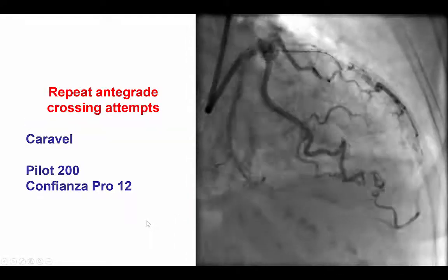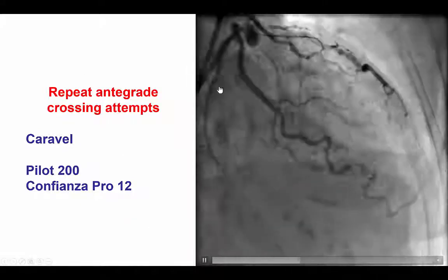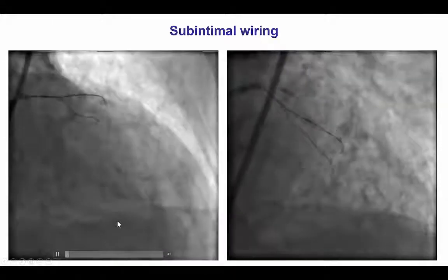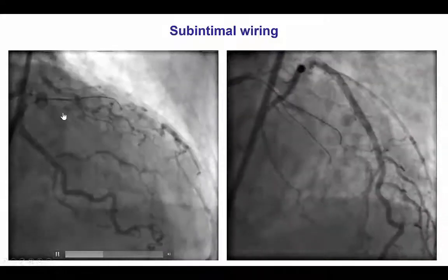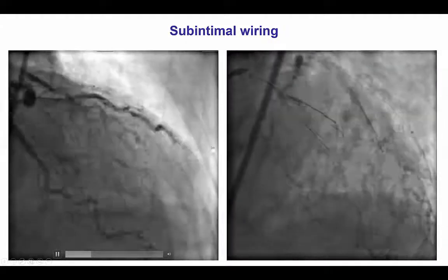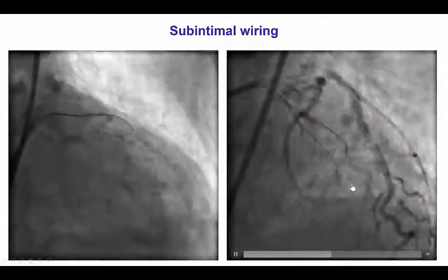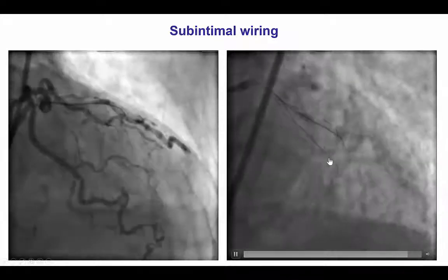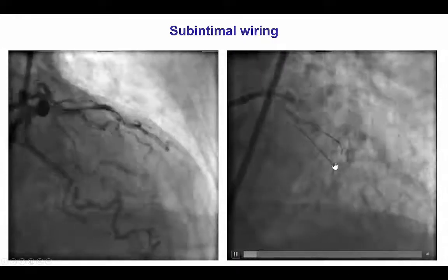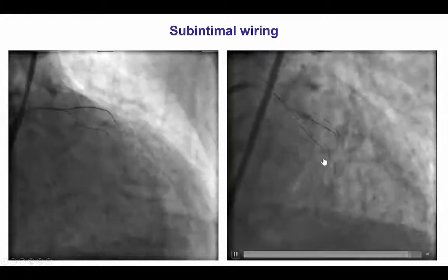We switched back to the antegrade approach, advanced a microcatheter to the proximal cap, and tried again with the Pilot 200 and a Confianza Pro 12 guidewire. This time we were able to advance the wire into the subintimal space, as confirmed by injection showing that the guidewire in the LAD is dancing in sync with the distal true lumen. So we had subintimal crossing from the LAD into the occlusion.